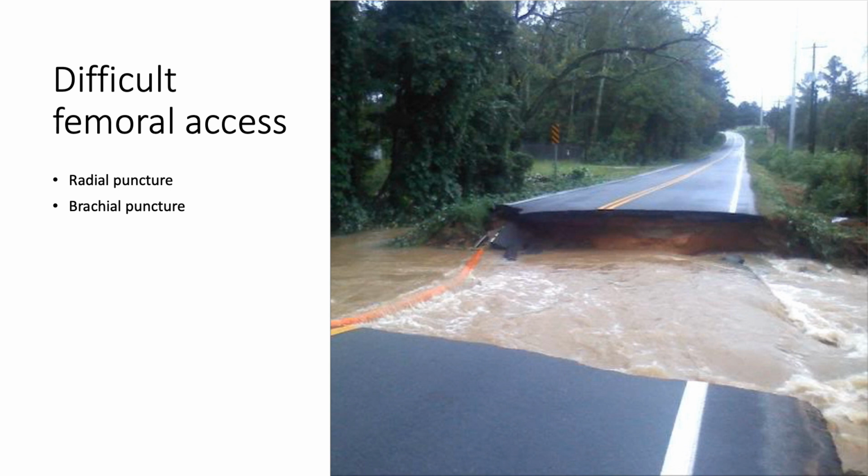What happens in a situation like this? There's no femoral artery, there's no access at all. Then you can try to come from the arm.